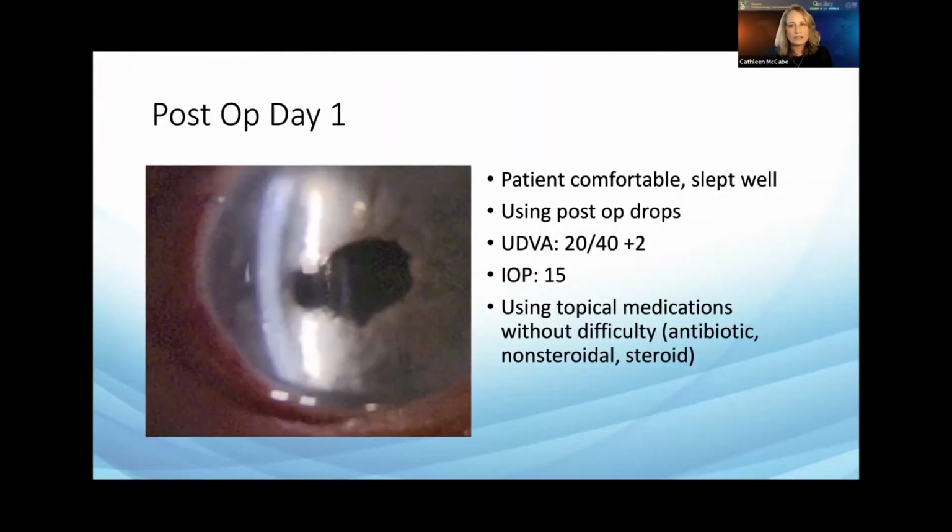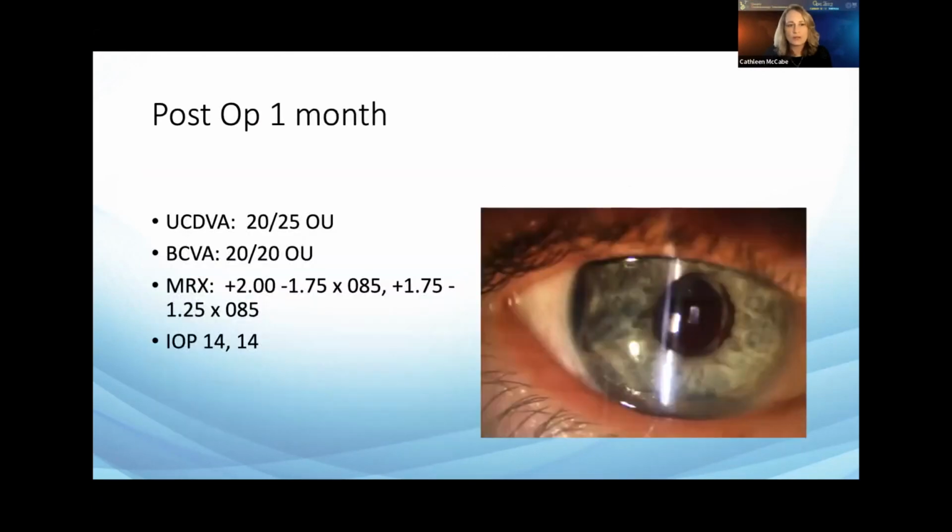So here he is on post-op day 1, not looking great. There's a lot of corneal edema there and some irregular margin to the pupil on the side of the iridodialysis, but he was seeing pretty well. Pressure was good. I didn't have a very sophisticated slit lamp camera here, so this is probably with my phone at the time. And he was using all of his drops appropriately.